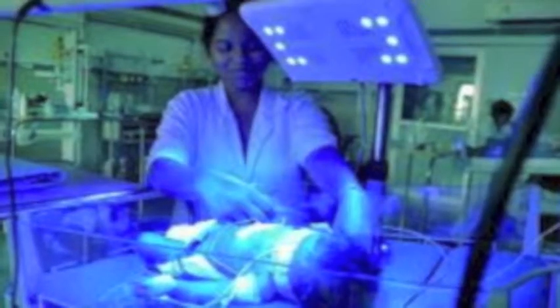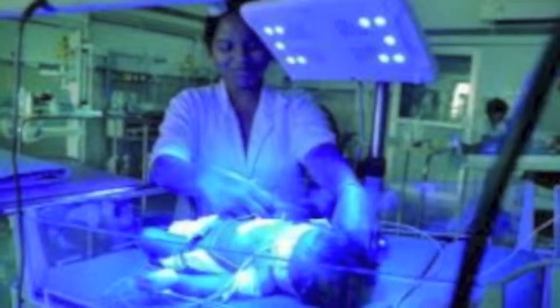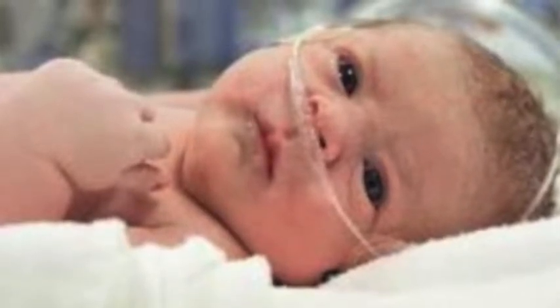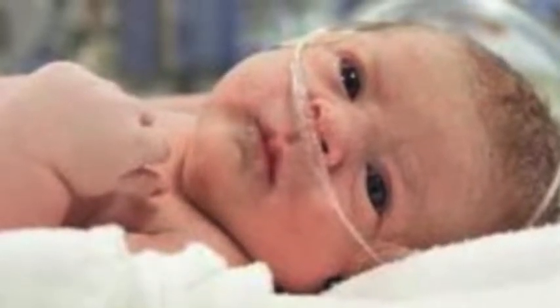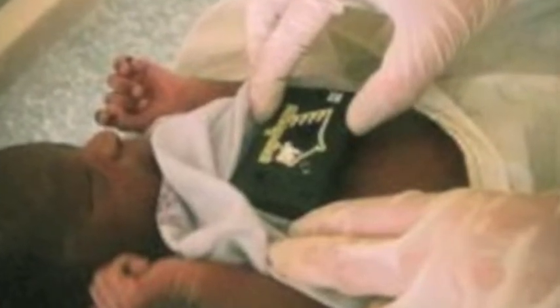The use of isolettes isn't limited to premature babies. They are used for a wide variety of cases such as jaundice, added oxygen, monitoring of heart rate, and blood pressure. The function and abilities of isolettes have improved through the years as technology excels, but they still fail to improve on one problem: bonding.